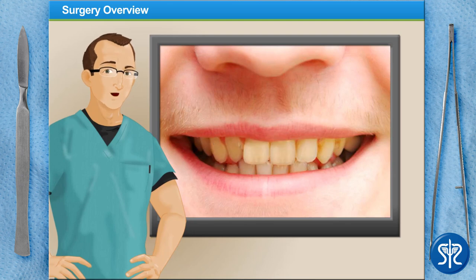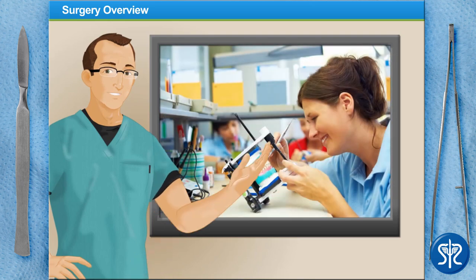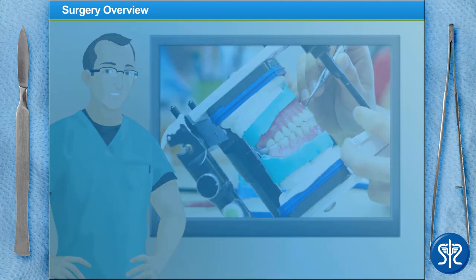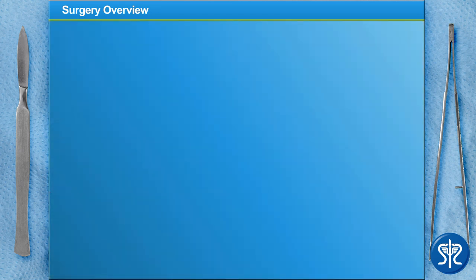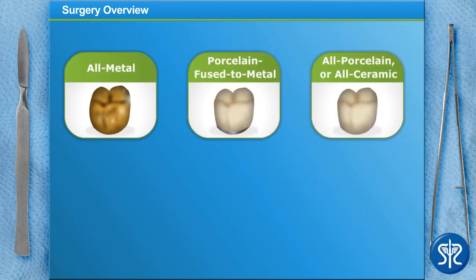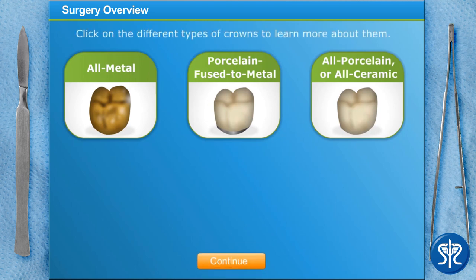Before we begin, let's review the types of crowns used in dentistry. First up, temporary crowns — these are placed over a patient's tooth while they wait for their permanent crown. They're usually prefabricated and made of plastic or stainless steel. A patient's permanent crown can be all-metal, porcelain fused to metal, all-porcelain, or all-ceramic, each with their own advantages and disadvantages. Click on the different types of crowns to learn more about them.